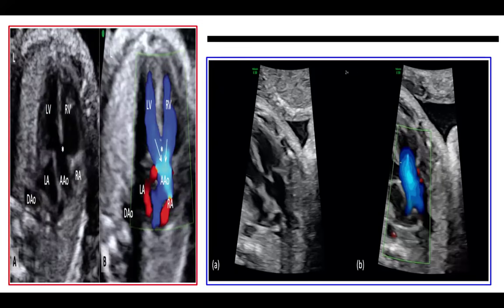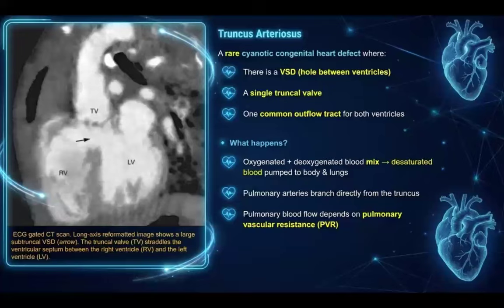I'm not going to tell you which is which. We're going to look at these separately. So with truncus, I was able to find a CT scan of a truncus, and this particular one almost looks like the trunk of an elephant, just upside down. I was like, wow, look at that. You can see this trunk of a vessel in the center of the heart. Notice that there is one single truncal valve. Also, what they're pointing out is the VSD.